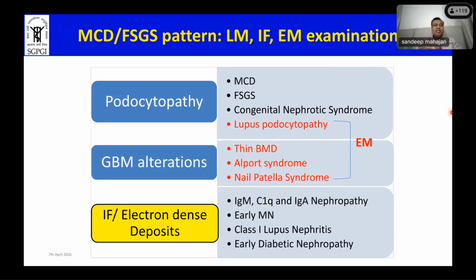And also analyzing all the three components, as she has very beautifully pointed out, the same morphology, even a normal looking morphology, can be harboring so many diagnoses. So to actually come to that, you would have to do all the three staining patterns to arrive at a correct diagnosis. And that would decide upon the further management.